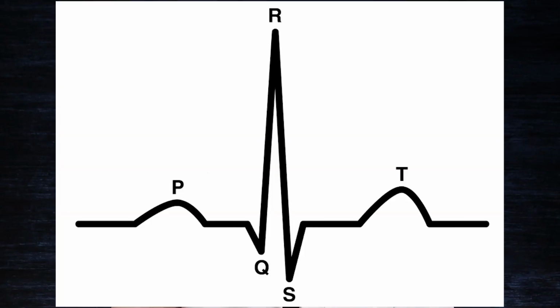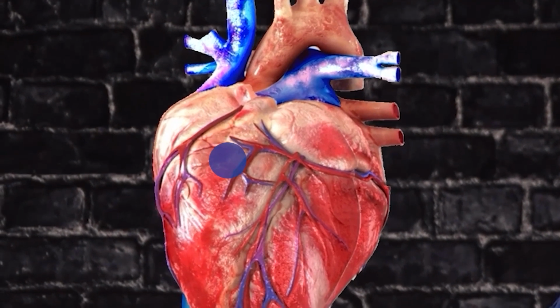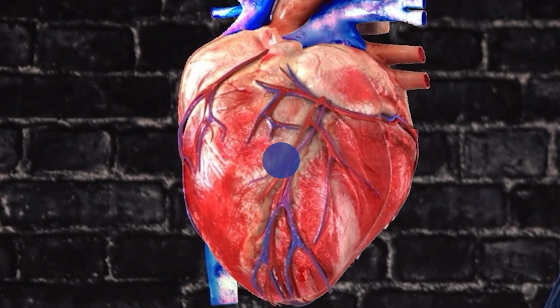As you know, when you look at an ECG waveform, you see all these little bumps. And if you take a closer peek at this one, you'll see that this little teeny tiny bump, which is known as the P wave, this is where electricity originates from what we call the sinoatrial node, which is sitting at the top of the right atrium. This SA node generates electricity and begins to send it across the atria to what's called the AV node, or the atrioventricular node, and eventually subsequent contraction of the ventricles. But as it travels from the SA node to get to the AV node, it crosses over the muscular areas of the atria and it causes its contraction, and that contraction shows up as a P wave.